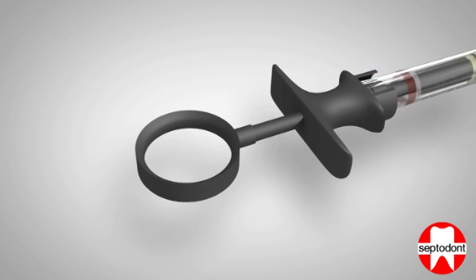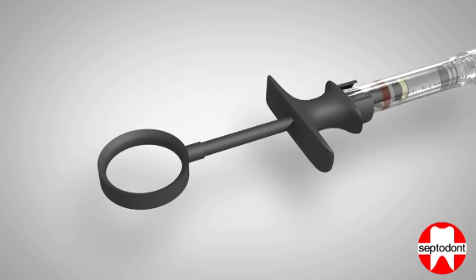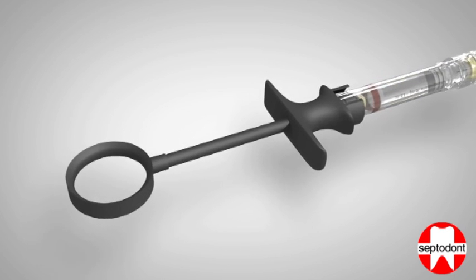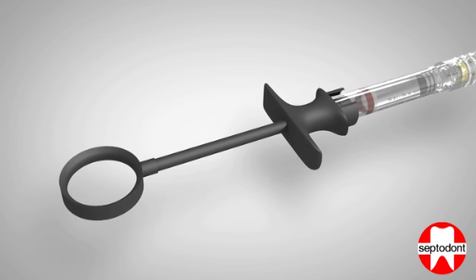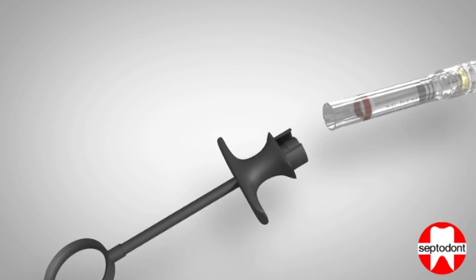If you wish to remove the cartridge from the syringe prior to disposal, pull the handle plunger back fully, ensuring that no part of the plunger remains inside the glass body of the anaesthetic cartridge.